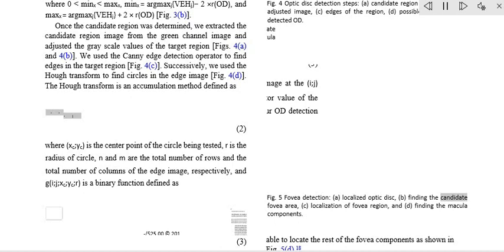The edge histogram was calculated using the edge filter responses at each 2 by 2 non-overlapping block of each subimage. A block was assigned to the edge whenever the filter response was a maximum value. Hence, the number of elements in the edge histogram feature is 80, the union of 5-bin histograms of each 16 subimages.